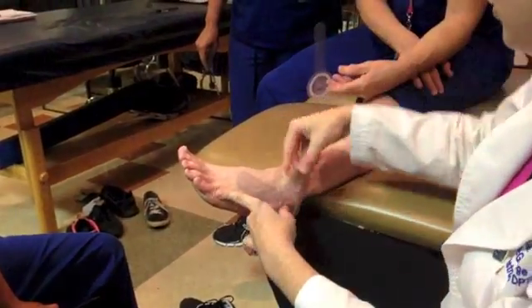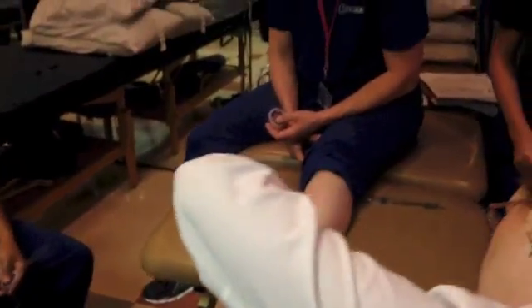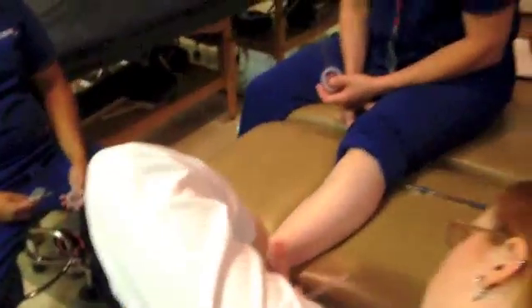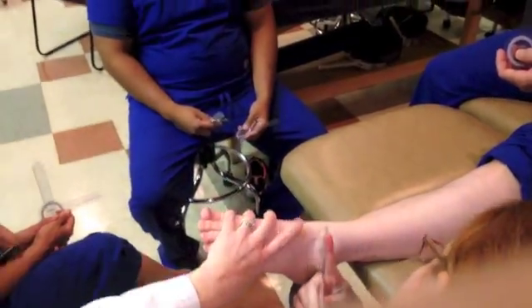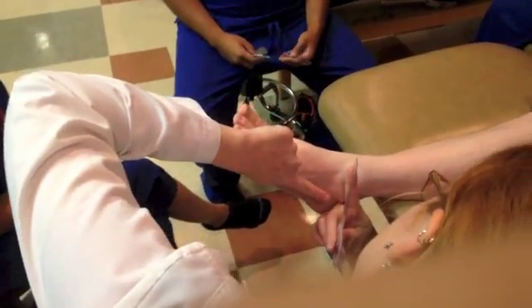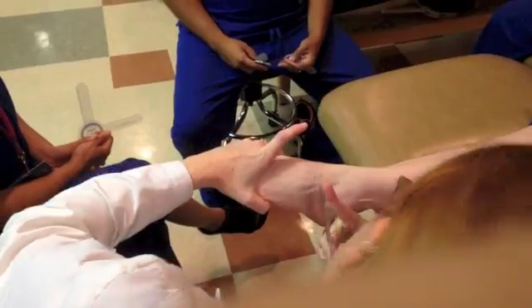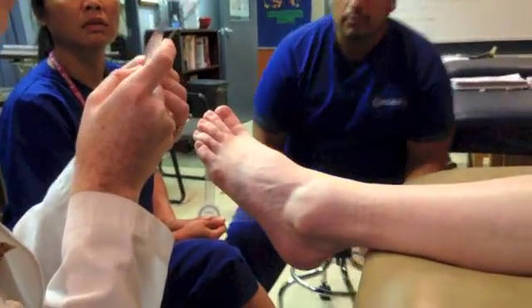So there's my fifth metatarsal. I've got my fulcrum, my stationary arm, and then I'm going to switch my grip a little bit further. So if this is zero — what do you think that is? About 30, 35. Yeah, it's going to be closer to 30 to 40. We're looking at the outside red numbers — the first outside red number is 20. So if I go to where the black number says 120, that would be 30.